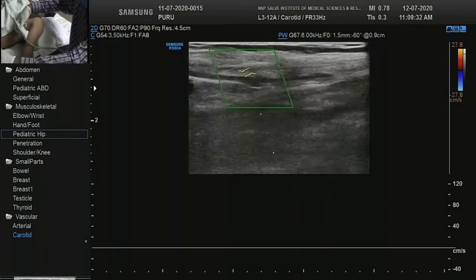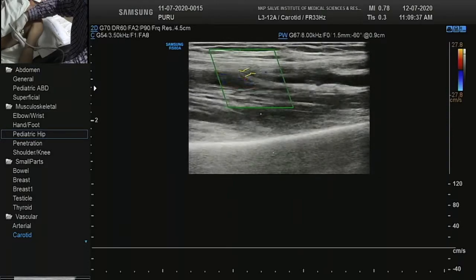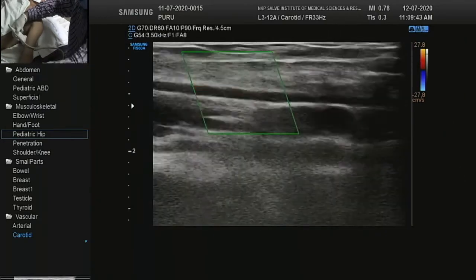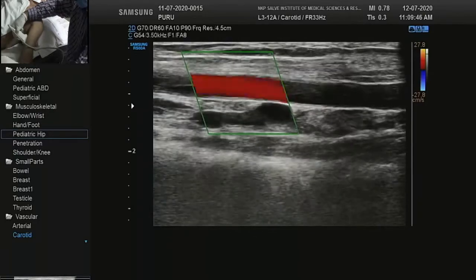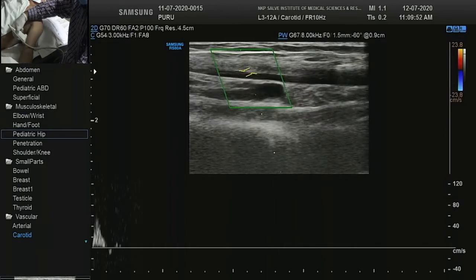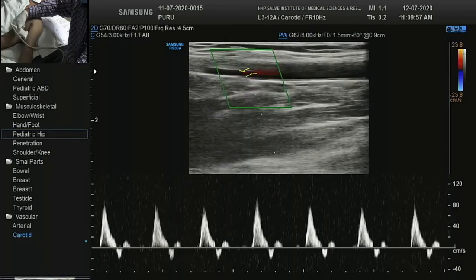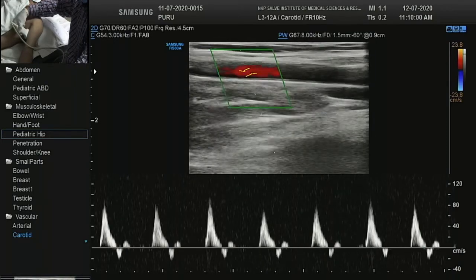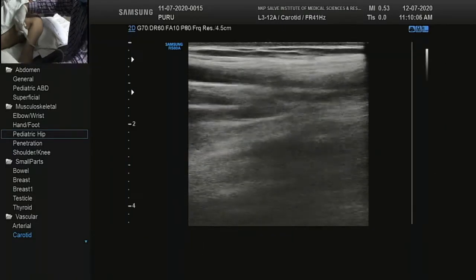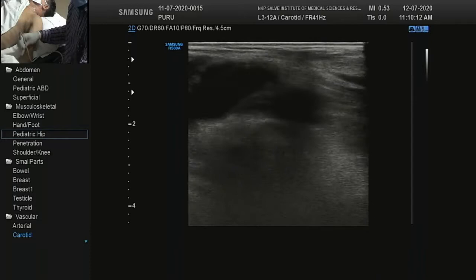So whenever you are very proficient, you can do this thing also. You can do it in continuous mode, or there can be all three things done there. This thing also you can do. Just keep on screening, keep on color, keep the spectrum, everything you can do, but not initially. Initially you should follow the simple protocols, and that will shorten your learning curve.